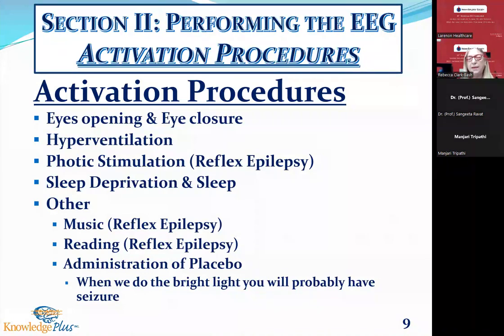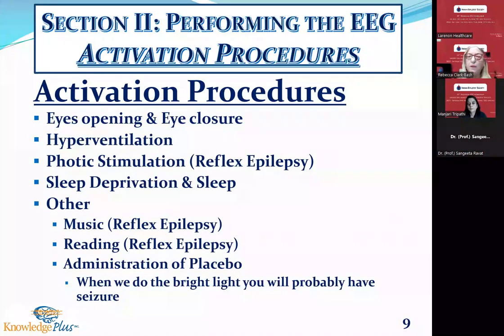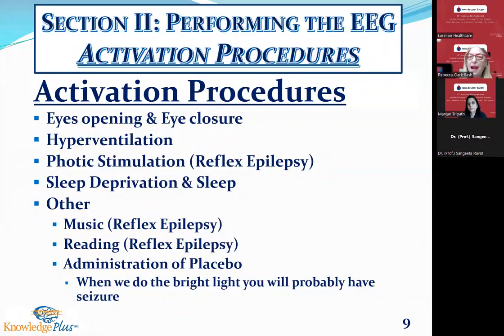And with the photics, we'll talk about exactly the parameters of that for each activation procedure. Now, as soon as photic is done, I used to wait till the end of the recording, but then they are sleepy or sleeping. And if they're nodding off during photic, it's not going to have any value. So again, they're wide awake. I do their photic stimulation. And then when that's done, I'll start my hyperventilation. Again, I'll talk about the parameters of that in just a bit. With hyperventilation, you have to be a cheerleader to get that patient to do it in a manner that really facilitates finding an abnormality if one exists. We'll talk more about that later.